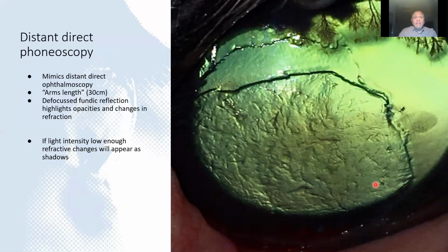These are the sort of images we can get. We mentioned before about changing the light intensity. If we drop the light intensity really low, we start to see very subtle changes, these dark shadows, these tiny little things that look like pine needles on the surface of the eye. These are just individual collagen fibers at the base of a keratectomy site. They're all transparent, but at very low light intensities, they start to appear as opacities. As we increase the light intensity, or the exposure on the camera, they will start to disappear. We can see the edge of the keratectomy site, which again looks dark, and the edge of the epithelium and the vessels.